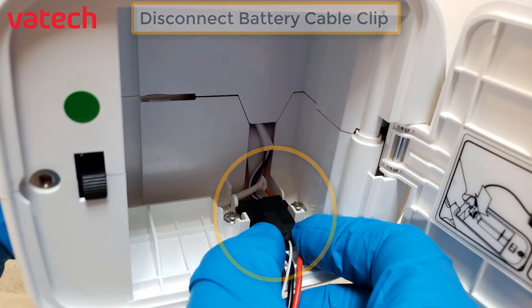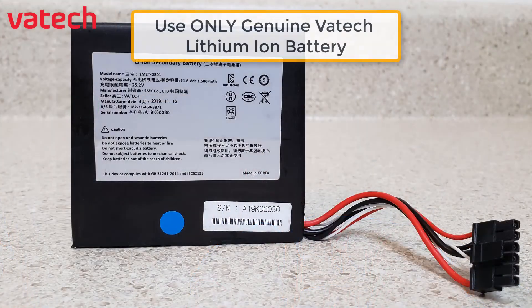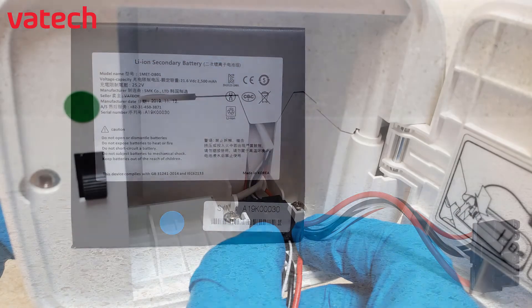Disconnect the battery clip and use only genuine Vautec Lithium-Ion batteries.